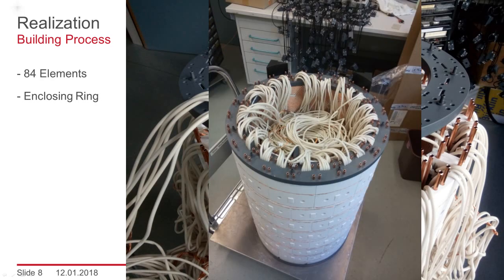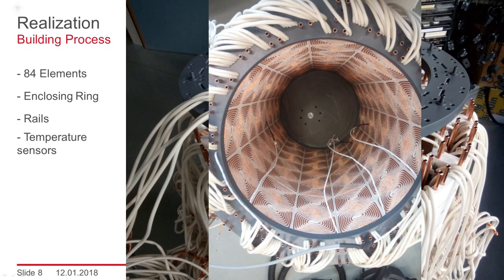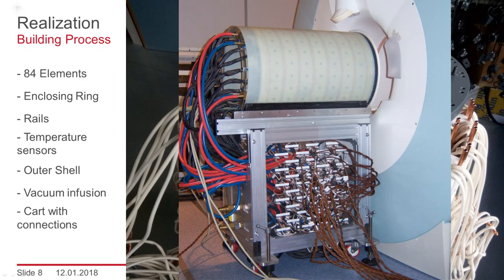An enclosing ring was added, then rails were added. In the whole assembly, temperature sensors are embedded. The rails in combination with sheets of glass fiber reinforced plastic form the outer shell. The whole assembly was infused with epoxy under vacuum in-house. In this image, you see the finalized coil on a handling unit where all elements can be electrically connected on the side panels of the cart.